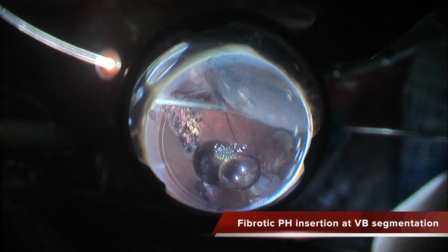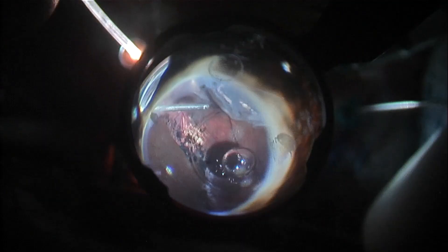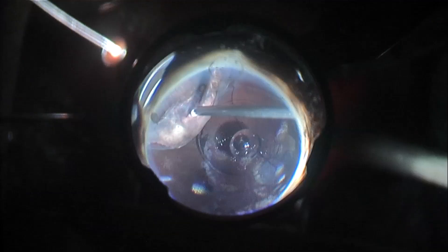Now I am completing the segmentation of this peripheral vitreous tunnel in the superior area. I can see there is a micro tear that probably caused this redetachment. You can see the micro tear there. Once I have segmented and cut the insertion of the vitreous base, I am shaving this area and the temporal area as well with the cutter.